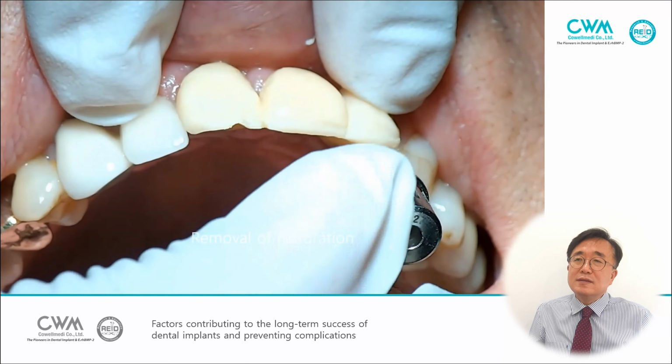The emergence profile is made during 2 weeks, and the impression coping is inserted.